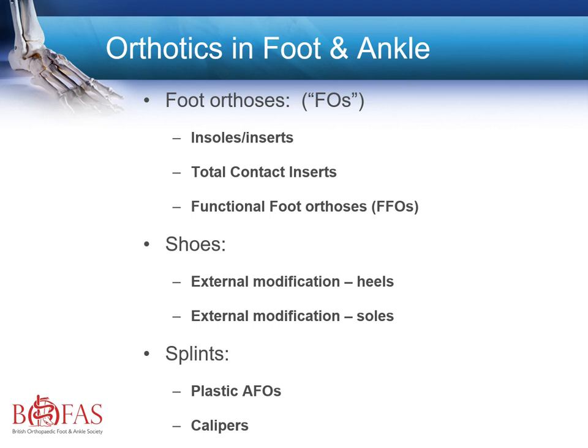As we said, foot orthoses or FOs can be simple insoles, they can be total contact inserts, or they can be a more functional foot orthosis. Shoes can have external modifications to the heel or external modifications to the sole. And of course, splints can be applied either the traditional caliper design or a more plastic lightweight AFO.